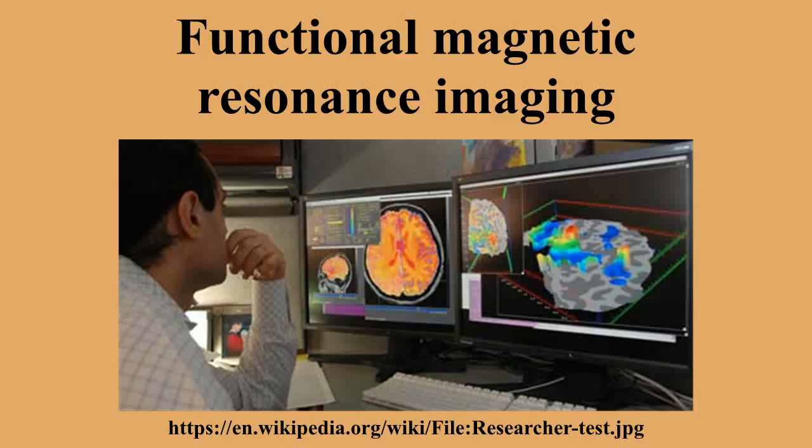In humans, electrodes can be implanted only in patients who need surgery as treatment, but evidence suggests a similar relationship at least for the auditory cortex and the primary visual cortex. Activation locations detected by BOLD fMRI in cortical areas are known to tally with CBF-based functional maps from PET scans. Some regions just a few millimeters in size, such as the lateral geniculate nucleus of the thalamus, which relays visual inputs from the retina to the visual cortex, have been shown to generate the BOLD signal correctly when presented with visual input.